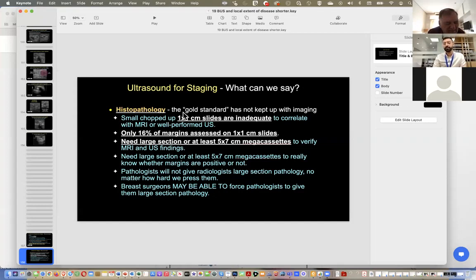I'm Dr. Jwala from India, and it's been a pleasure listening to you, Dr. Stavros. My question was, would I be allowed to mention, especially in a case of invasive cancer plus DCIS disease, the word DCIS in my notes, in my ultrasound report? Could I be saying that there are multiple tumors, probably invasive tumors with intervening thickened ducts representing DCIS? Can I use that word in my reports?